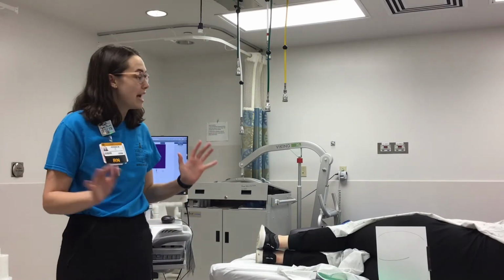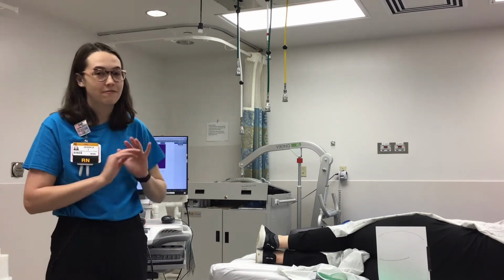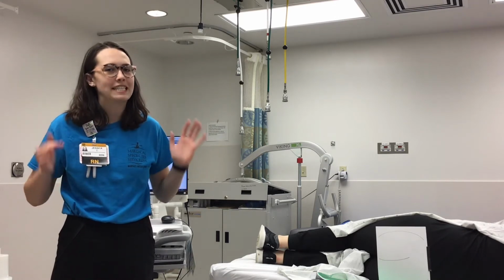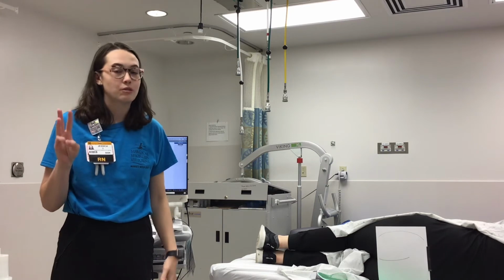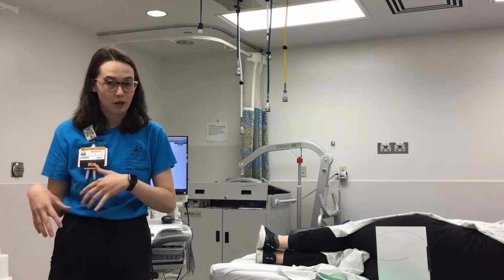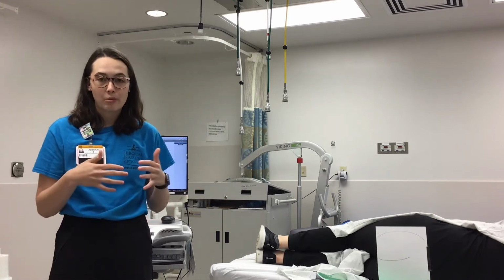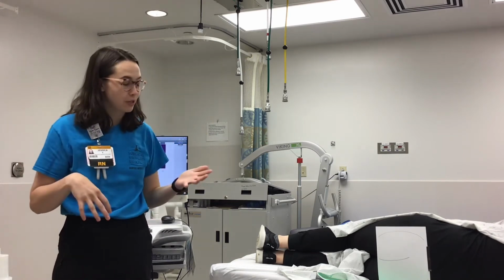Okay, now we have our patient positioned properly, our Wound Scout is fired up and ready to go, and now the moment you've all been waiting for, we get to actually scan our patient. There are 3 different locations that the Wound Scout is going to prompt you to scan: your sacrum, left heel, and right heel, in that order. And then, if you want to, you can add other bony prominences or other areas of the skin if you are concerned about those afterwards.